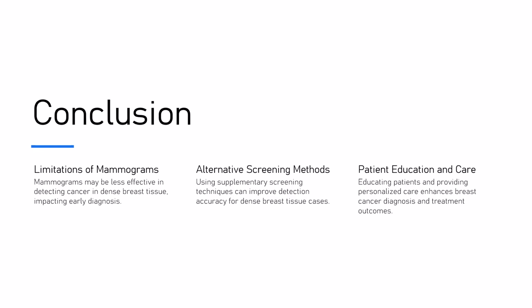Mammograms have limitations in detecting breast cancer in dense breast tissue, which can reduce early detection effectiveness, as we mentioned before. So, understanding of these challenges and utilizing alternative screening methods, along of course with patient education and personalized care, is very essential to improving breast cancer diagnosis and outcomes.